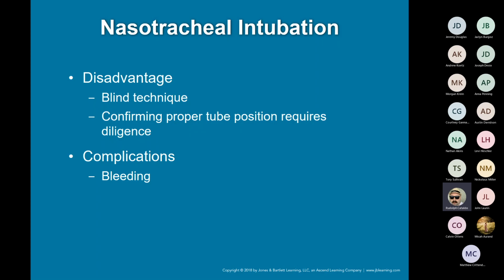It is a blind technique. There's not a whole lot of intubation techniques that are blind, that we just literally insert them blindly, kind of like we would a King or an iGel or something like that. You have a little bit more liability on you, to be honest, because you are hoping that that's in the right position because you're totally isolating the airway. And then you're going to confirm the method like normal means.